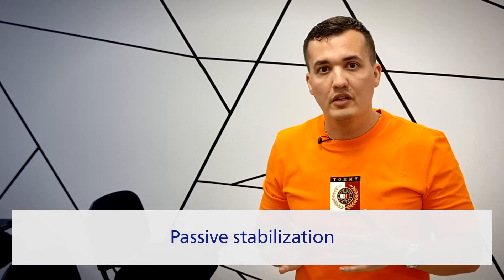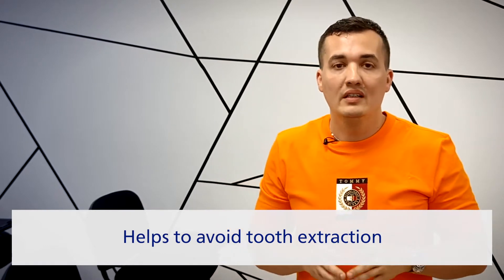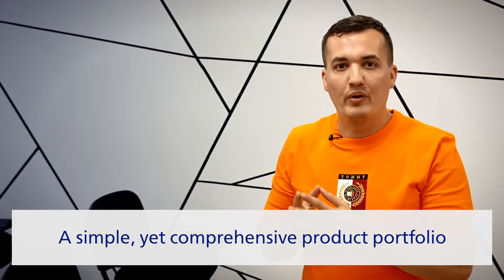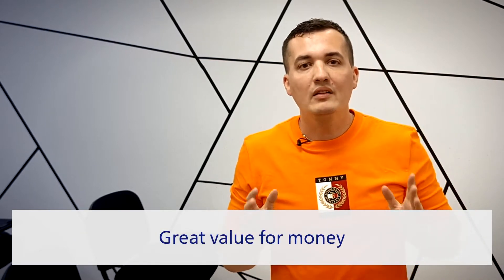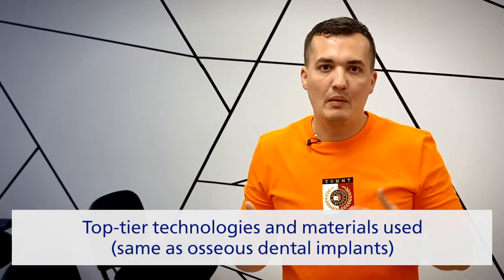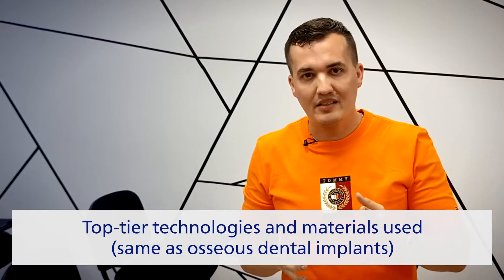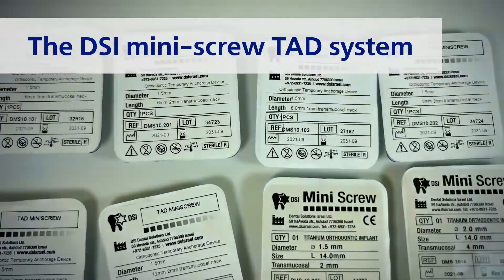In most cases, using the mini implants — also known as TADS — eliminates the need for additional extra-oral appliances. The main areas for treatment with mini screws are active tooth movements or passive stabilization; extractions can almost always be avoided. DSI TADS users benefit not only from a simple yet comprehensive portfolio with only a few components, but also from great value for money.